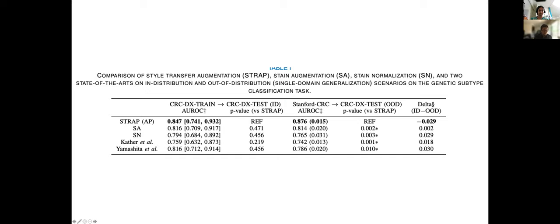Rikiya, sorry, I have just one quick question. For the training, with your STRAP style model, you actually augmented each of the sample images using multiple styles, right? Actually, each time I apply one style, selected randomly. So for each sample, you randomly pick one style for training. And for validation, you're doing the same? No. At inference time, I tested the model performance on the original histopathology images.